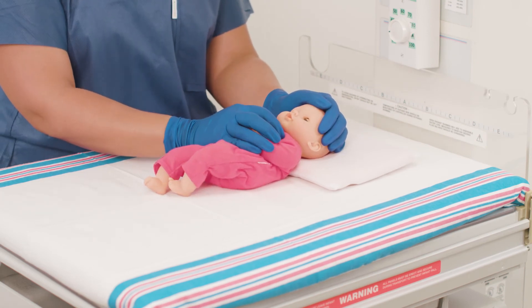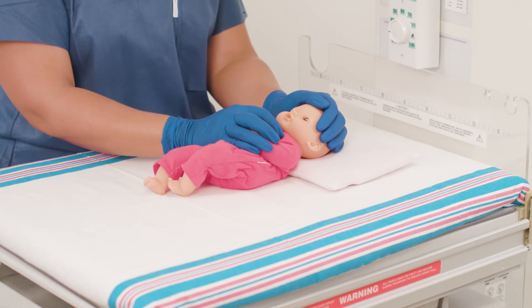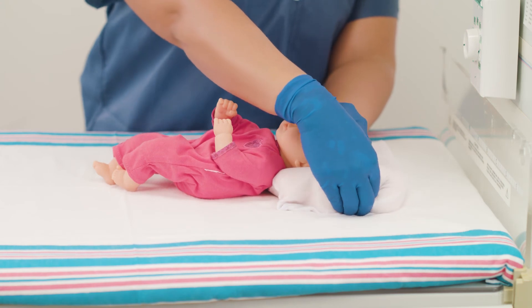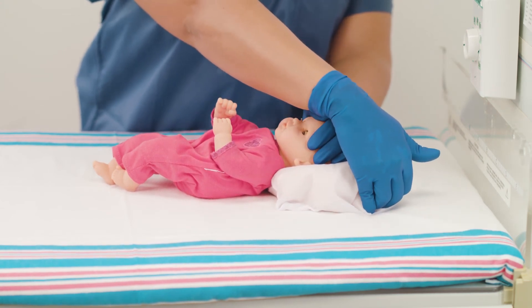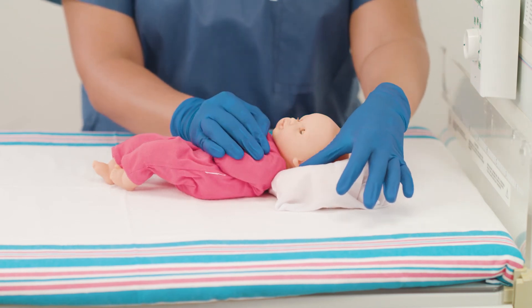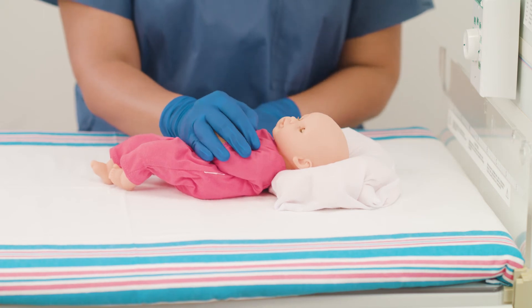If needed, create a slope towards the bottom to support the shoulders. Support the head and mold the sides of the positioner up and around the head. Use your finger or thumb to create a divot under each ear and for accommodating medical device tubes.